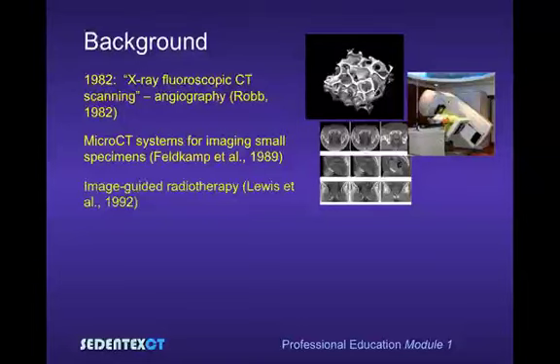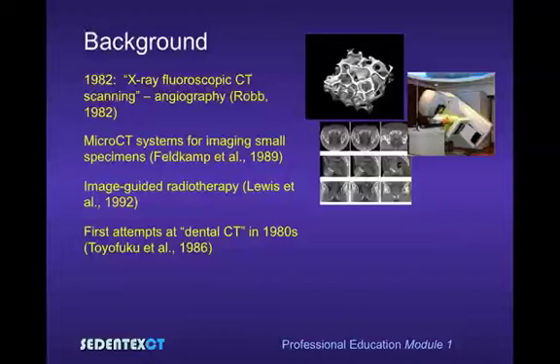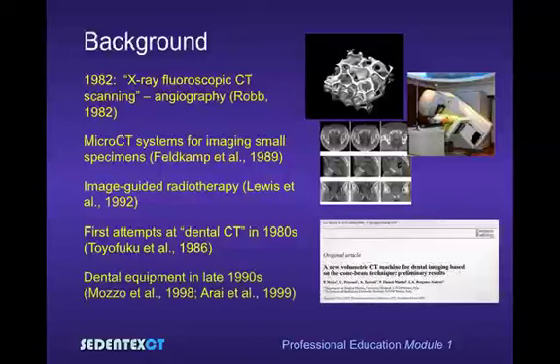Cone beam CT technology is used in image-guided radiotherapy. But the first attempts at dental CT were made in the 1980s in Japan, with dental equipment first being manufactured and presented in the very late 1990s in Italy and Japan.